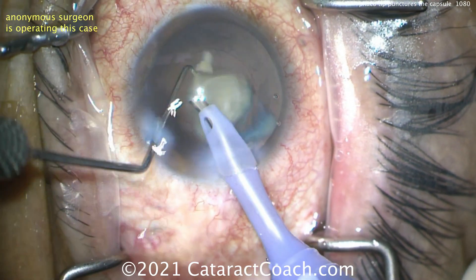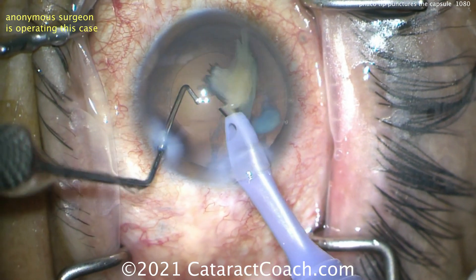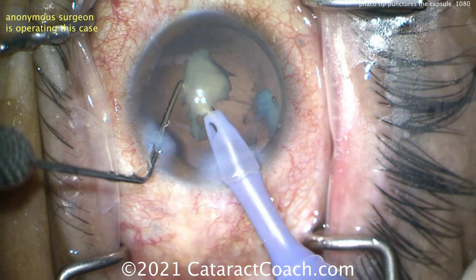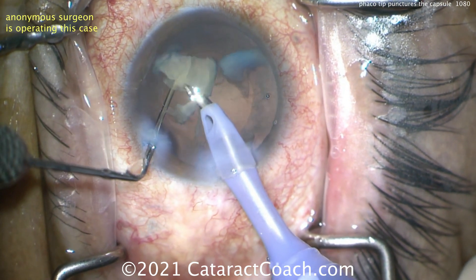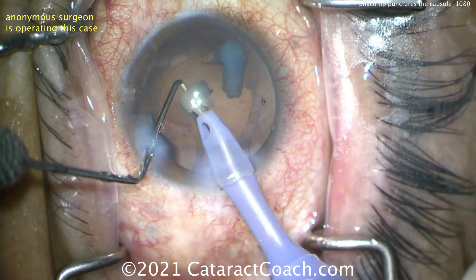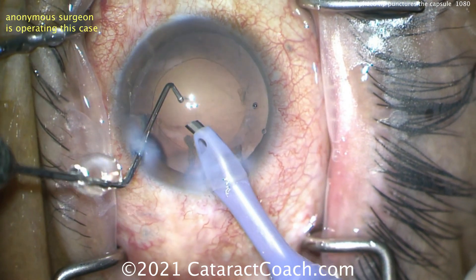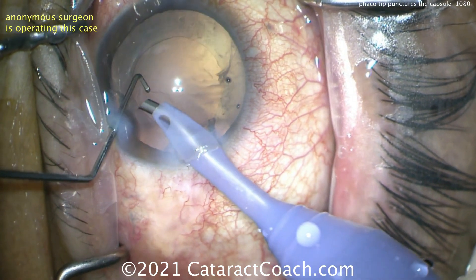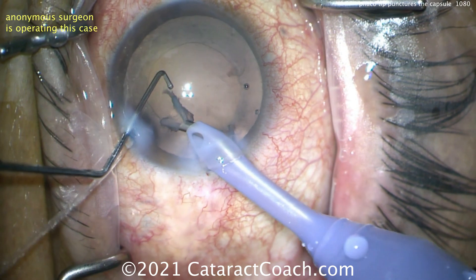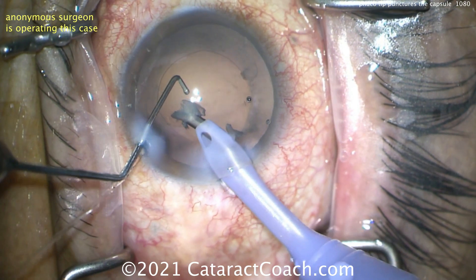At the end here, when removing the last bit of cataract, look how empty the capsular bag is. It's a white cataract, so there is no cortex, no epinuclear shell, nothing to weigh down the capsular bag. That flimsy bag is bouncing all around. Look at the position of that chopper tip — it's not in the safe position.